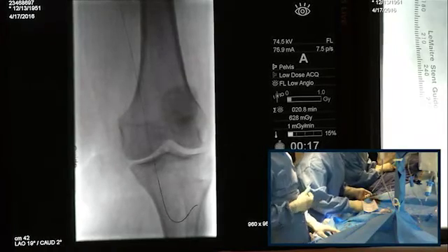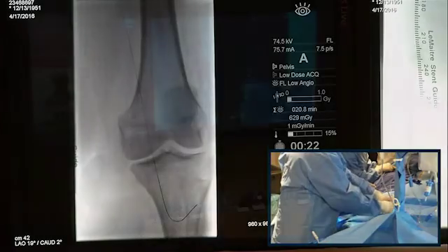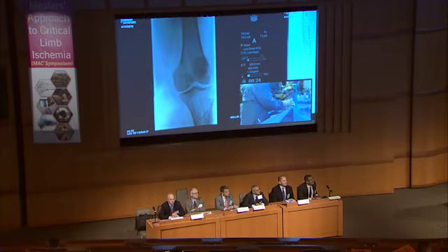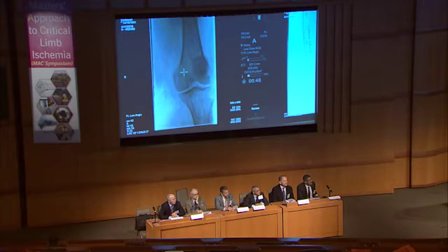So I still have a question. Yes, please. Sorry, over here, I'm to your left, but up here. Please. So here's the question. We've not put a balloon into the popliteal artery to occlude that artery and inject below to see how much, if any, fistula flow is coming from the tibials. Before you go covering all of this and losing access, don't you want to know all of that information? Because if it's the entire leg rather than a short profunda branch, then maybe the ischemia is so chronic that doing all of this, which we're about to do, shouldn't be done first.